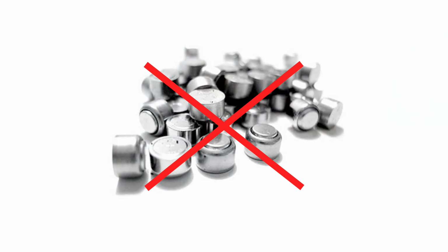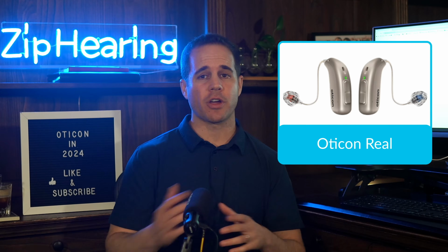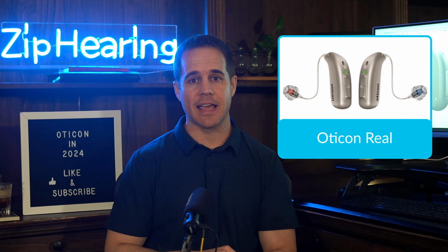Now, there is one downside to the Oticon Intent. As of mid-2024, it only comes rechargeable. So if you want a disposable battery version, either wait a bit, they'll probably eventually make it with a disposable battery, or look at the previous generation product, Oticon Real. Oticon Real is almost the same hearing aid as Intent, with the noticeable difference being that Oticon Real doesn't have the motion sensors that Intent does. So it's not going to be quite as good as Oticon Intent in noise, but still a very good hearing aid. So that covers Oticon Intent and Real.